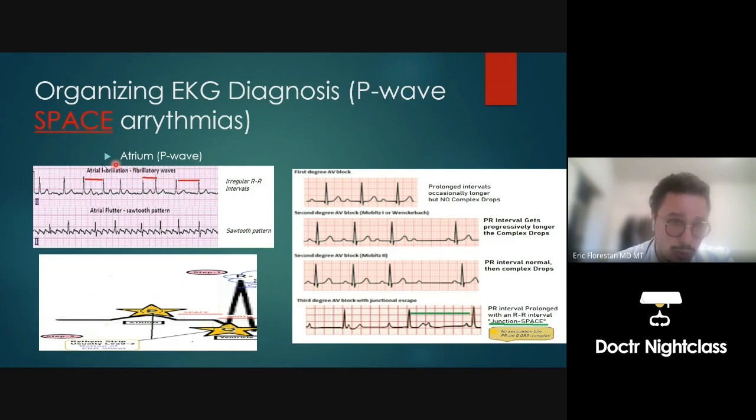Once you determine this, you don't have to look at all the other leads. You're never going to get an arrhythmia on an exam, and then they want you to know if there's a myocardial infarction too. You're not going to have two diagnoses on a question. It's not going to be an atrial fibrillation and a myocardial infarction. Once you find out the answer, go find the answer choice and click it and move on. So we only made it to step 2 here, right?